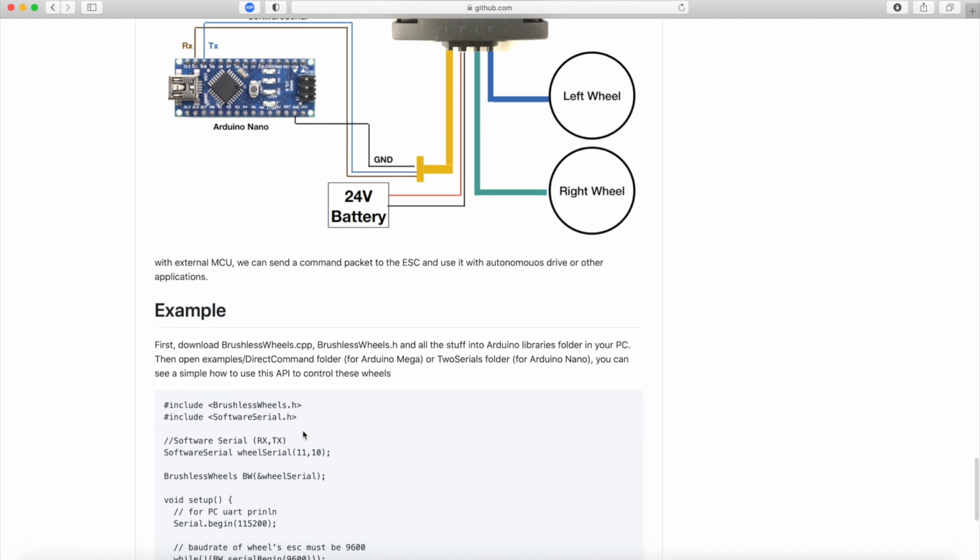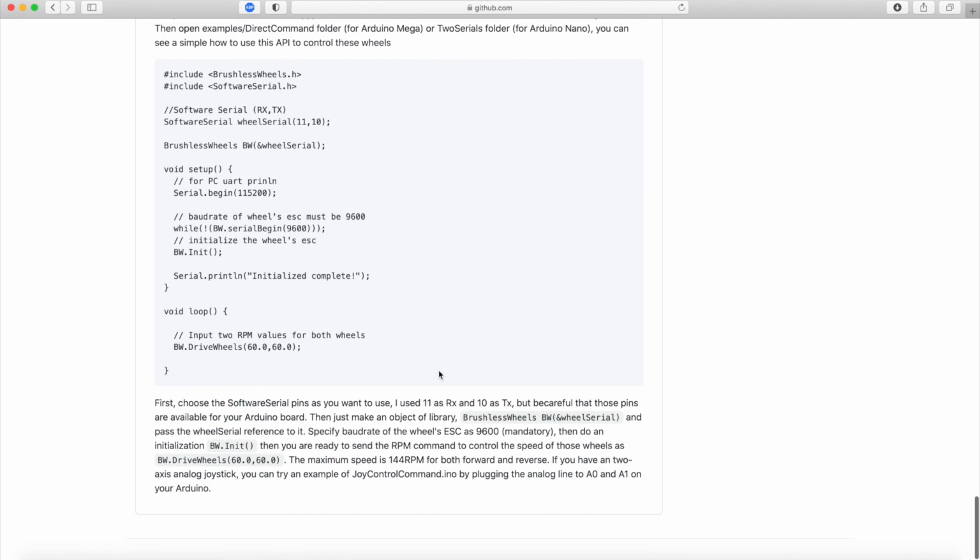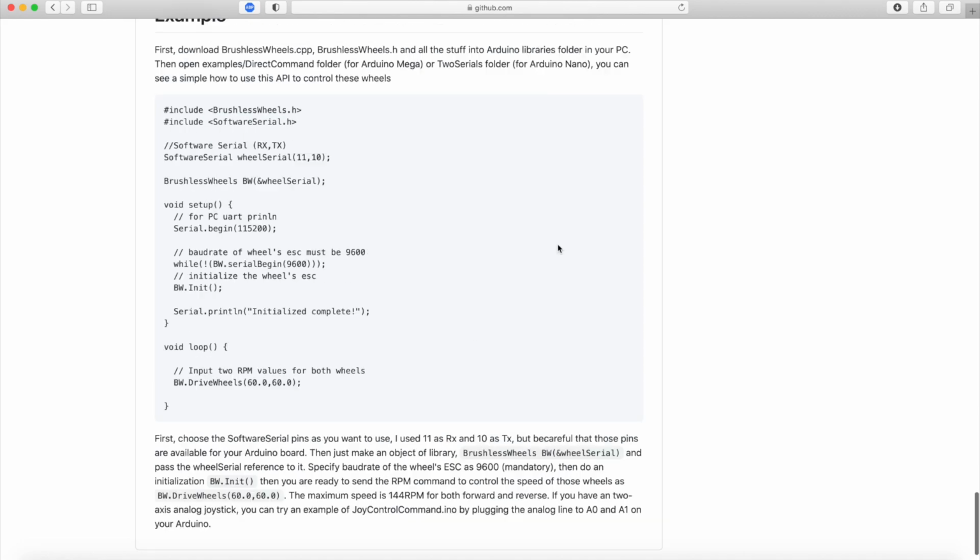I also have the example script as well. If you want to try, you can just download it and try it by yourself. And that is how I hacked this wheelchair and controlled it with Arduinos.